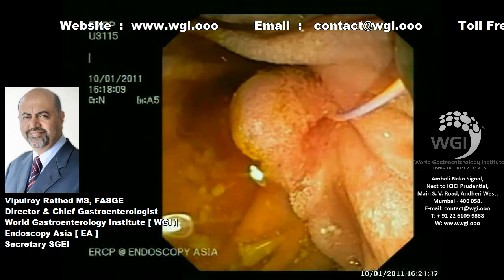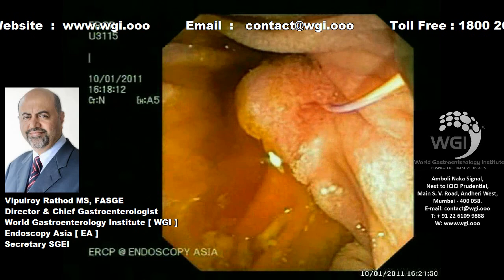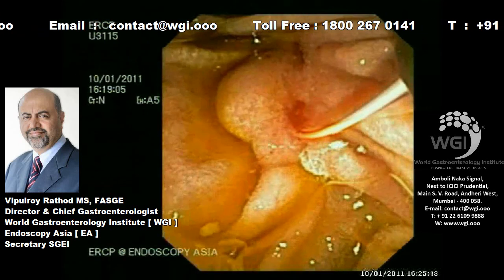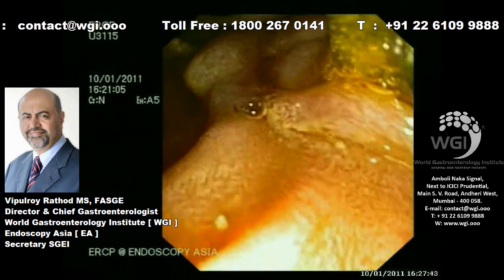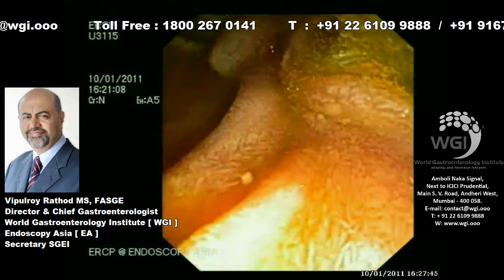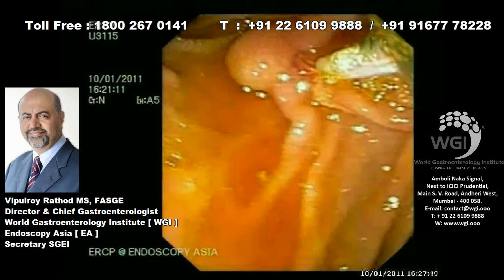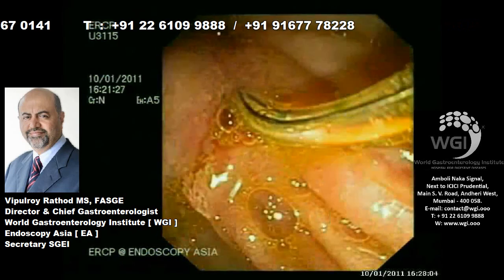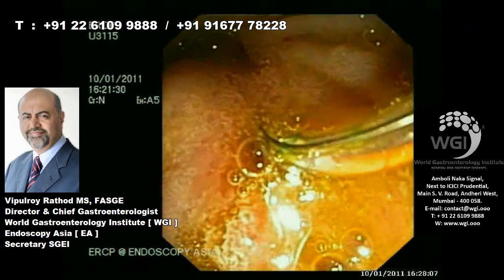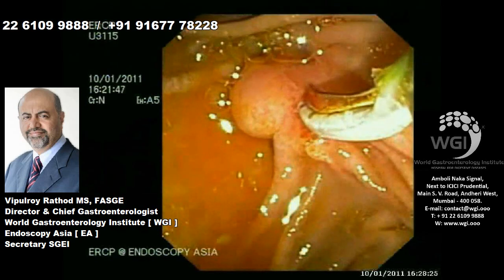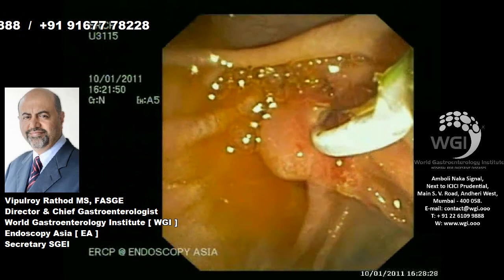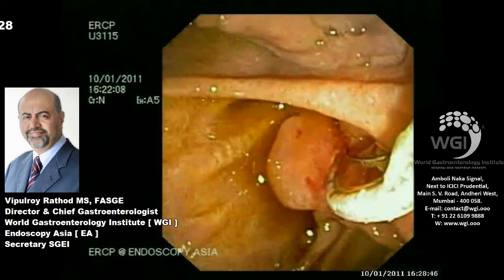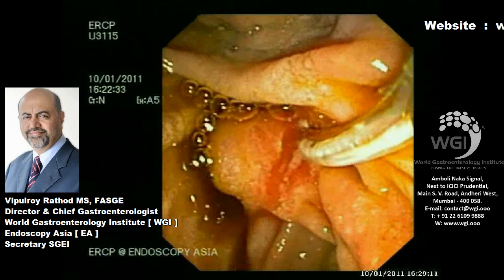At this stage, you can see that the previous endotherapy attempt was only a biliary sphincterotomy. I personally reckon that pancreatic sphincterotomy was not performed at that time. So now we are cannulating over the guide wire with a sphincterotome and performing a major papilla pancreatic sphincterotomy. There was no pancreatic sphincterotomy in the previous attempt — they likely only cannulated the bile duct and performed biliary sphincterotomy. We have now done a major papilla pancreatic sphincterotomy.